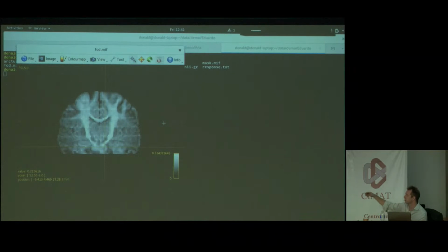It'll interleave, it'll come back every 8 slices to the next one. And that means that you've only got 8 slices worth of gap of time before the next adjacent slice gets excited, which means the crosstalk between that first slice and the next one has only had maybe a couple of seconds at most to recover. Whereas if you had a full odd and even interleave, it would be more like 5 seconds.